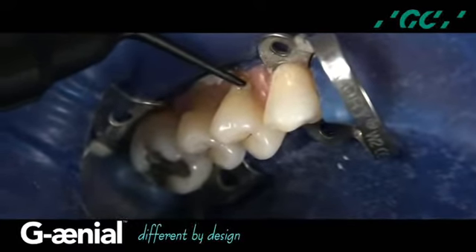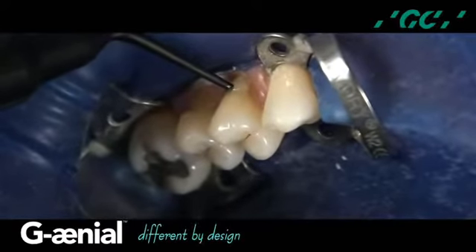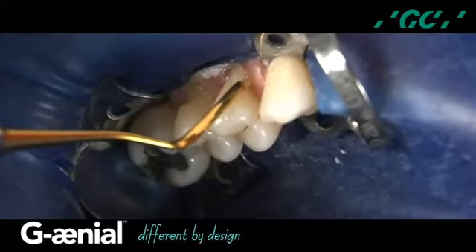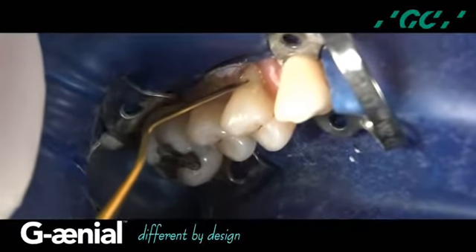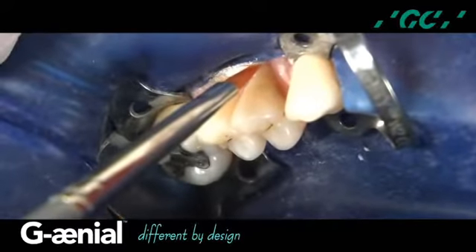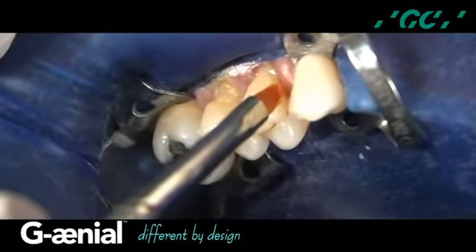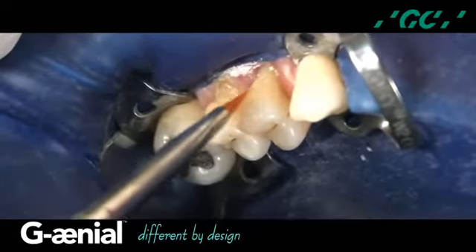Notice the material does not stick to the Gineo syringe tip as the material is extruded and distributed. The material is adapted with a long bladed instrument. It is important to anticipate the final enamel layer — not to overbuild the dentin layer, but to monitor the artificial dentin layer from the incisal aspect. The material is smoothed with a number 2 sable brush to the beveled enamel to allow for an optimal integration of the material with tooth structure, and each preparation is light cured for 10 seconds.